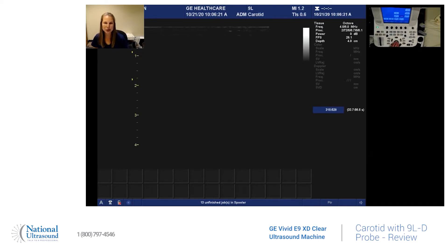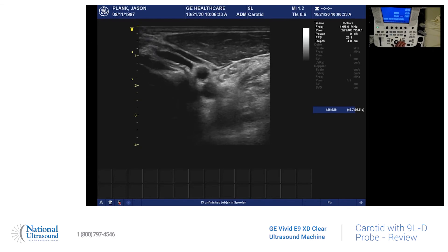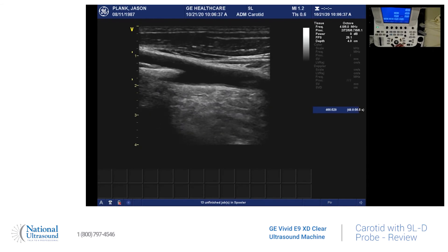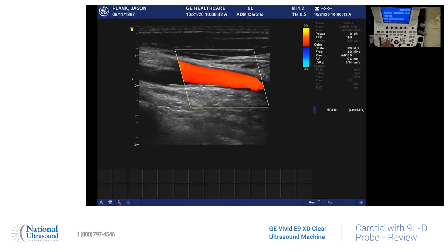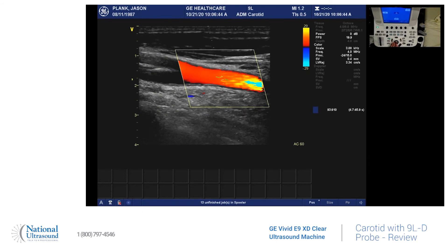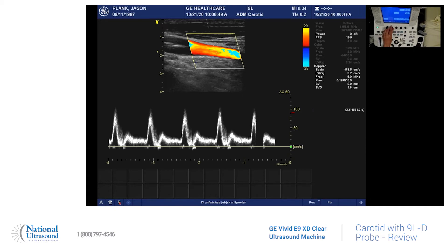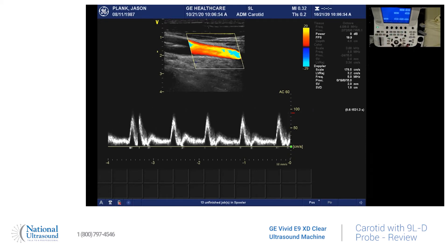So I'm on my main screen now, and I already have my patient information in. So when we go to scan, the color is just here on the keyboard — it fills in nicely. You're going to hit the cursor, and then pulse wave is right here also on the keyboard. If you need to use your scale, it's going to be right up here with these toggle keys. Baseline is also there.